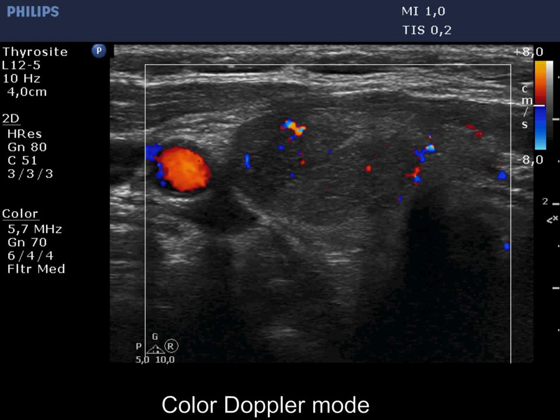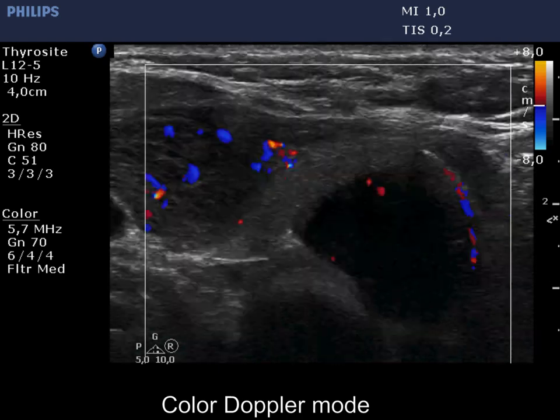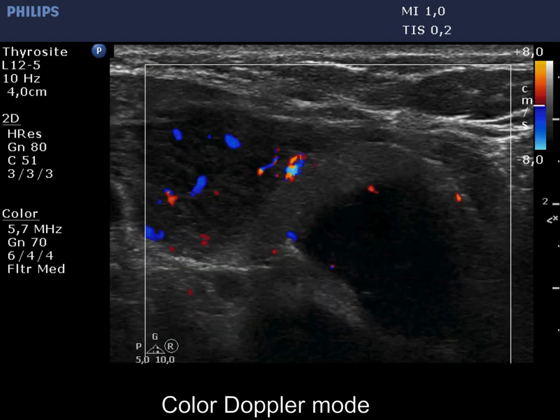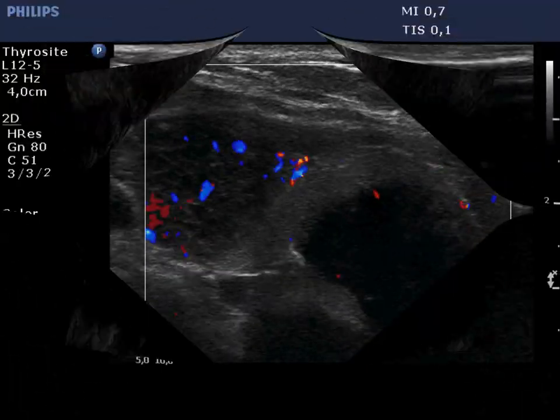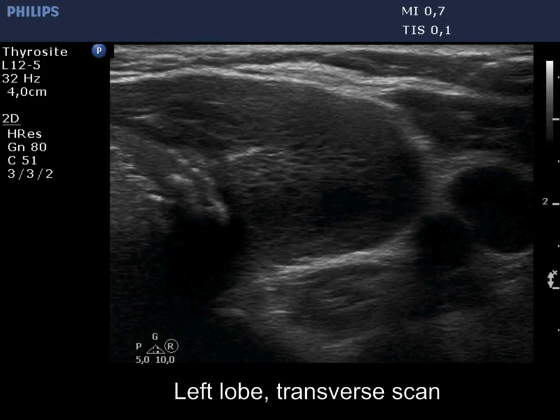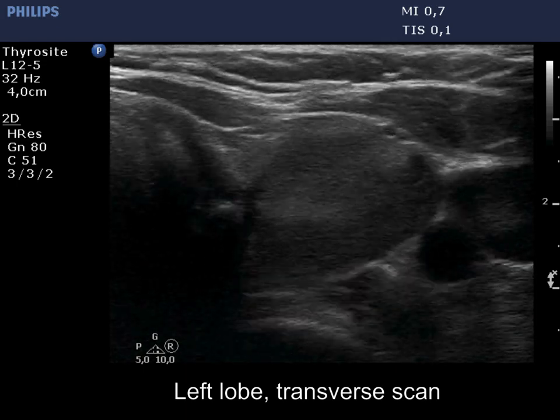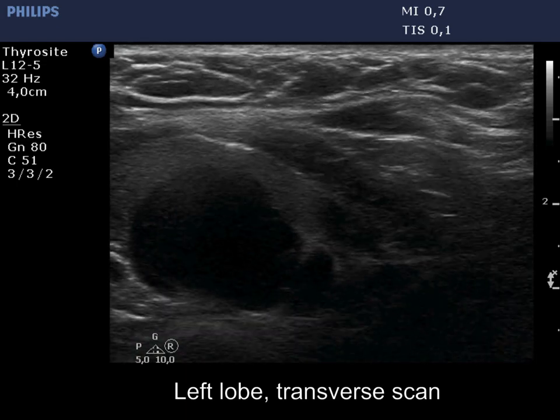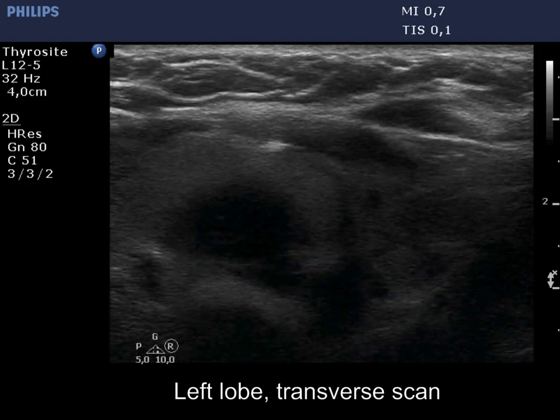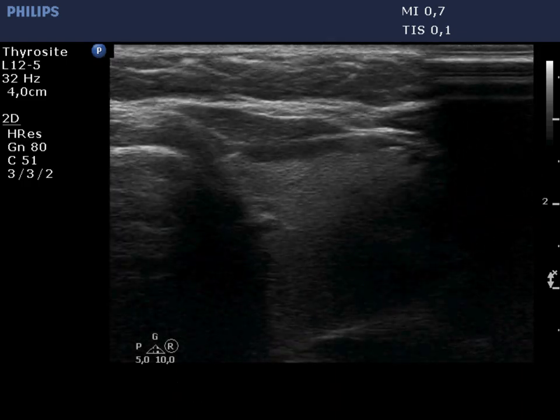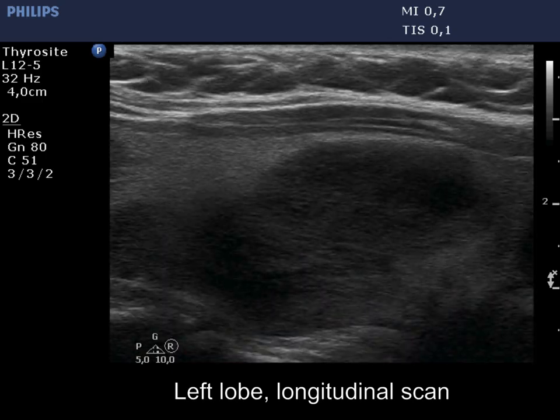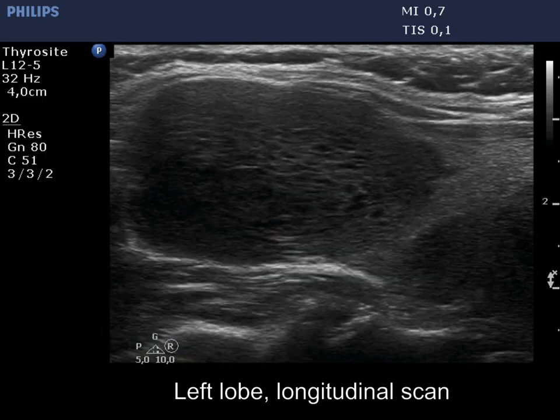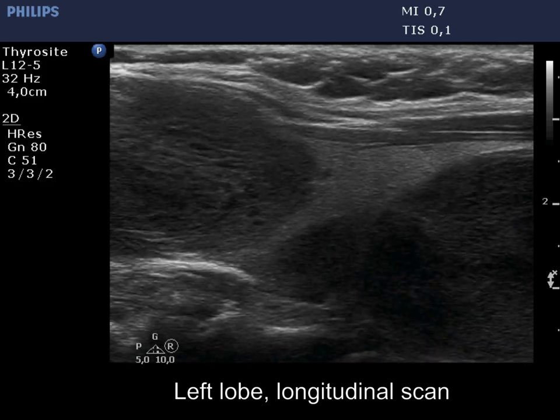The vascularity is increased in the upper while scanty in the lower nodule. The hypoechoic lesions in the left lobe have significantly increased in size. The anechoic areas do not show dorsal amplification; therefore these are probably solid and not cystic fields.